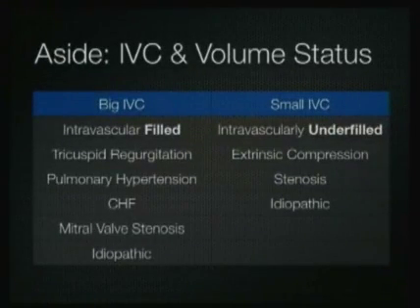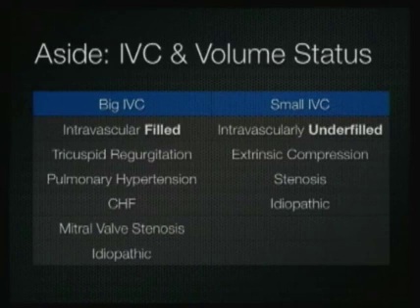And just as an aside, the inferior vena cava is talked about a lot in the literature as being a surrogate for volume status, but we have to remember that there are other things that can cause an IVC to be dilated or small, namely tricuspid regurgitation, pulmonary hypertension, heart failure, mitral valve stenosis, and sometimes people have an idiopathically enlarged IVC.